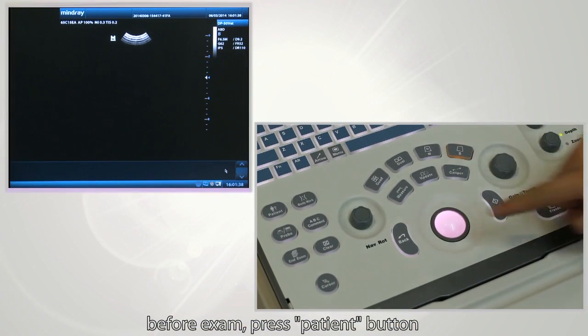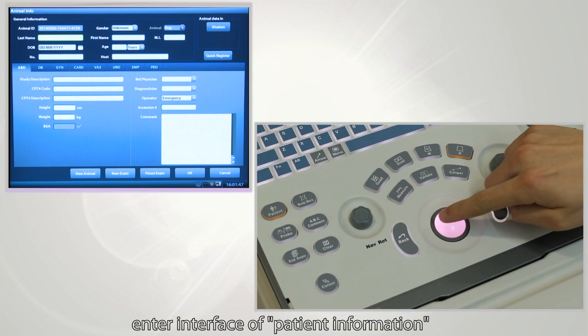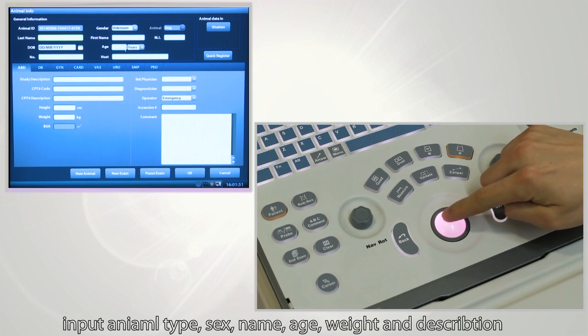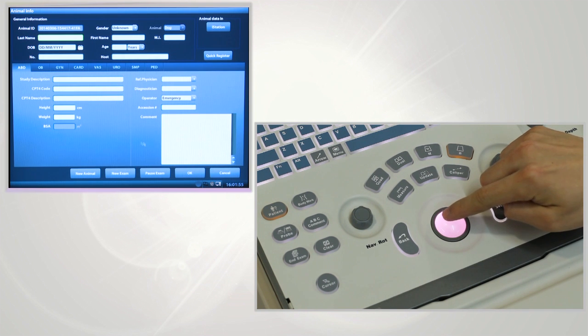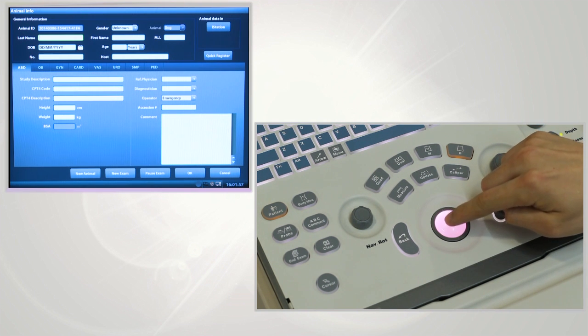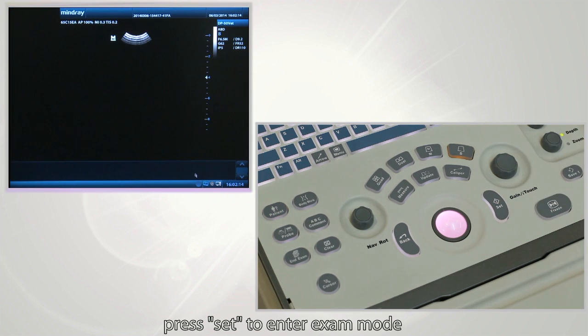Before the exam, press the patient button to enter the interface where you can enter patient information. Input the animal type, sex, name, age, weight, and description. Press Set to enter exam mode.